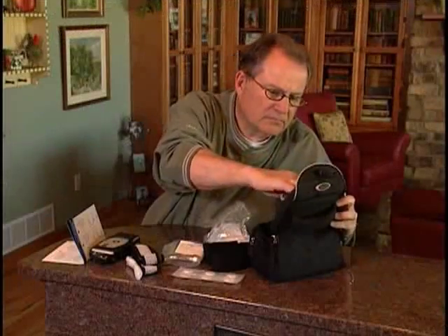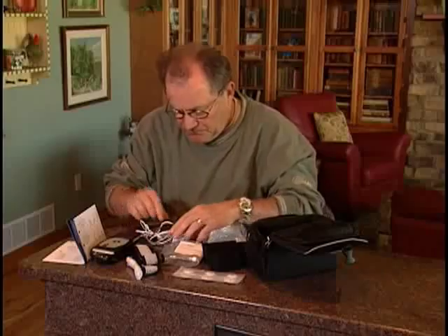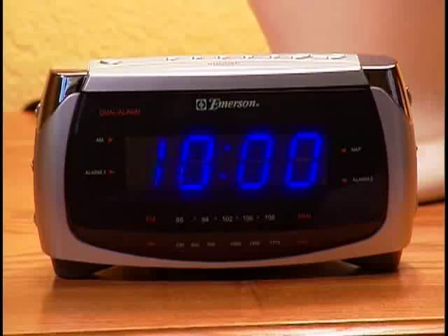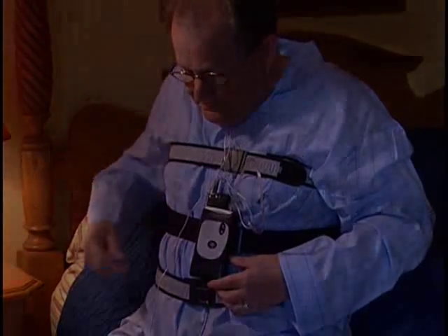We recommend that you read the Embletta hookup card and familiarize yourself with the Embletta and sensors before you prepare for your sleep study. The Embletta may have already been pre-programmed to start and stop recording at the appropriate time or times. Allow yourself at least half an hour before the start time of your study in order to attach all the sensors and get ready for bed.